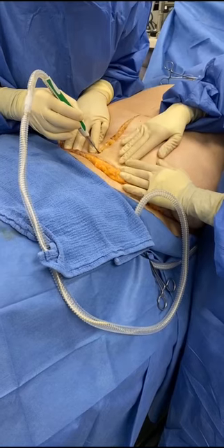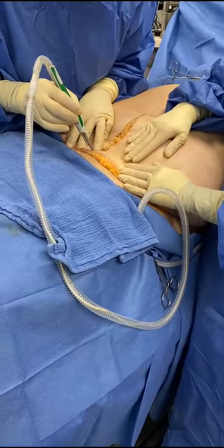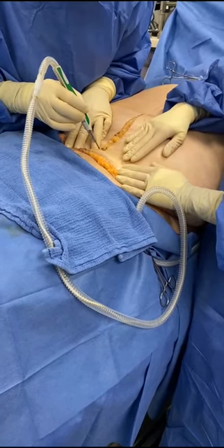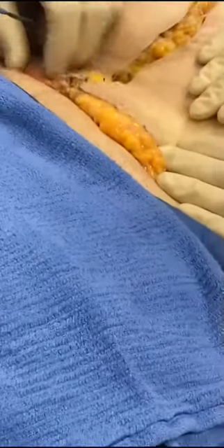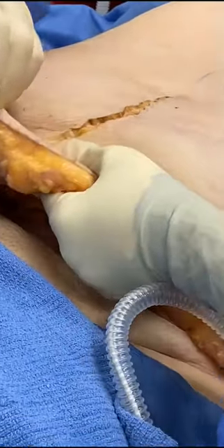There's a little blood vessel here. I don't know if you see it, but I just electrocoagulated it right away, and there is absolutely no bleeding. This is just incredible, right? There's a blood vessel right there. And so, let me show you inside, okay? Here. See, there is no bleeding at all. Let's do Instagram here too.